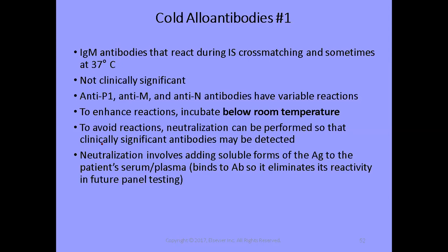Okay, so here's what happens. They can mask the presence, at least at immediate spin testing, right? If something else is there, we want to eliminate the reactions from these antibodies.